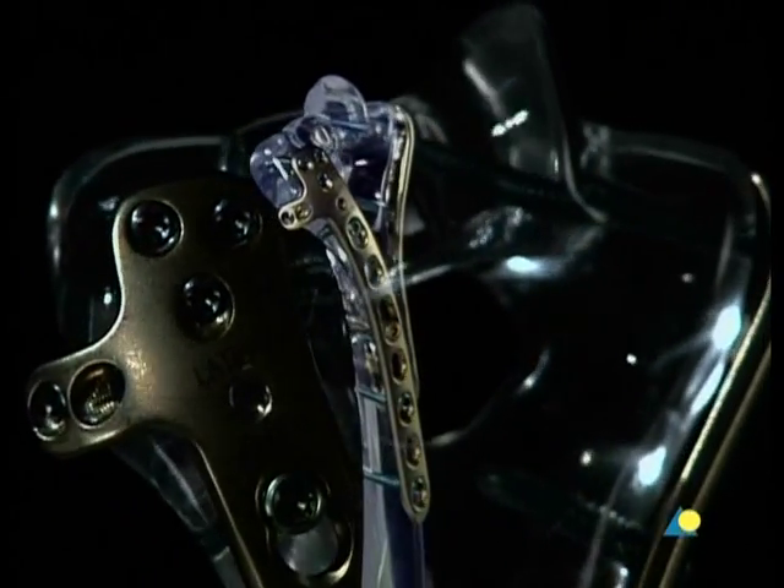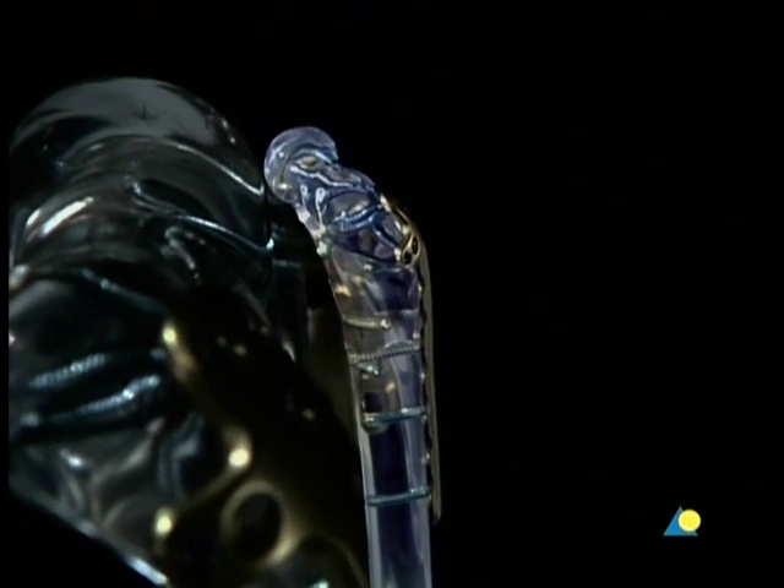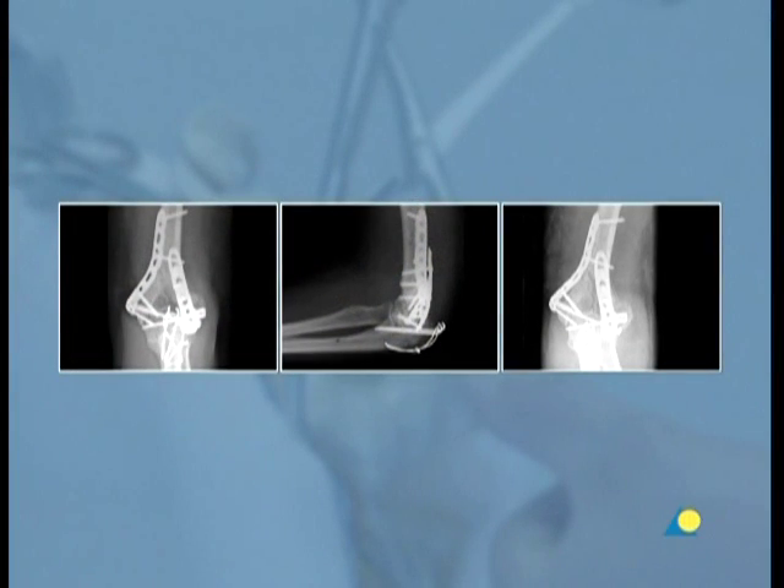Since C-type injuries are unstable joint fractures, as a rule, surgical stabilization is necessary. The goals of the procedure are the anatomical reconstruction of the joint, the restoration of axial mobility and stability, which allows early functional exercise of the elbow joint.